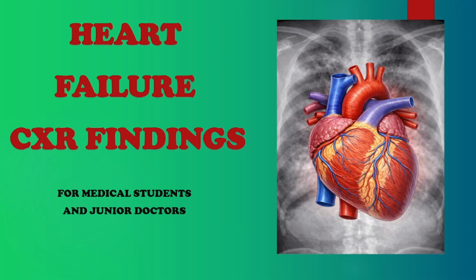Today it's about the most vital organ in the body, the heart. Please don't get heartbroken, although we are going to discuss the failing heart and its chest X-ray findings.